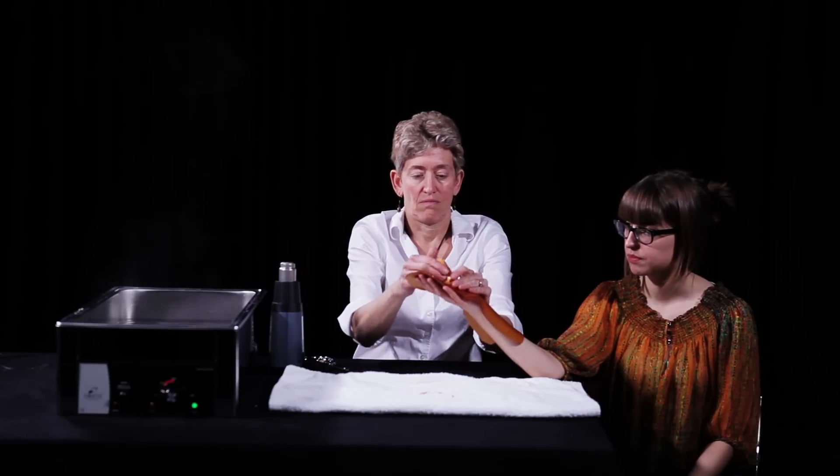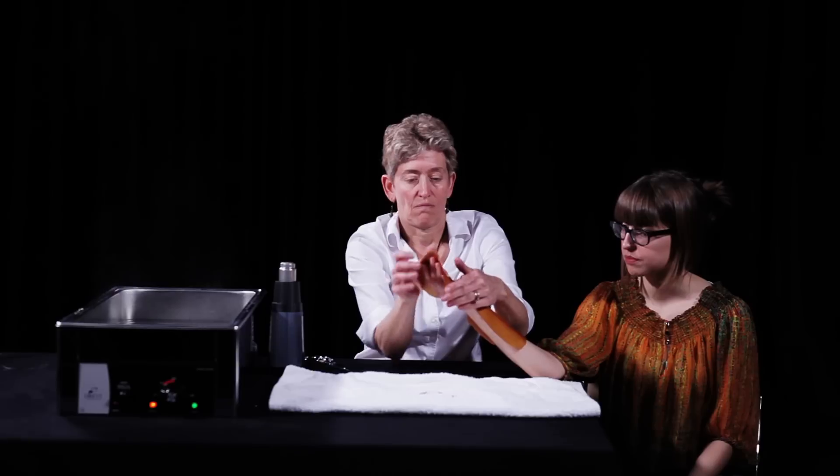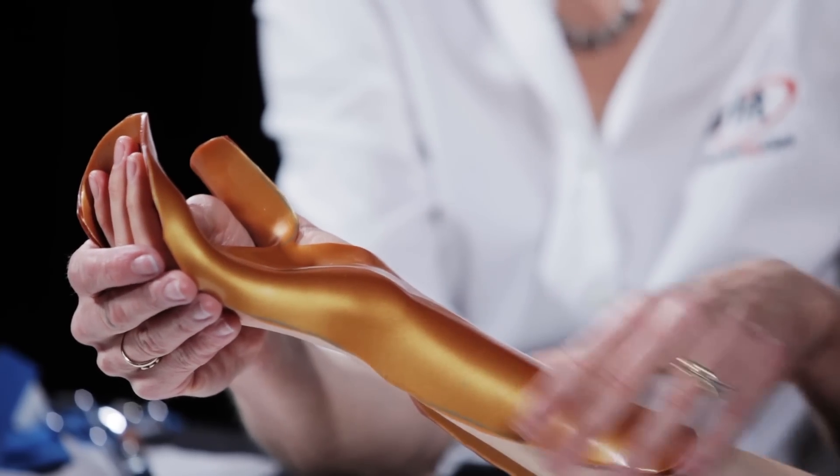Place the orthosis over the patient's hand, wrist and forearm, letting gravity assist. Stretch the material onto the first web space so that it conforms and offers support to the thumb and index finger.